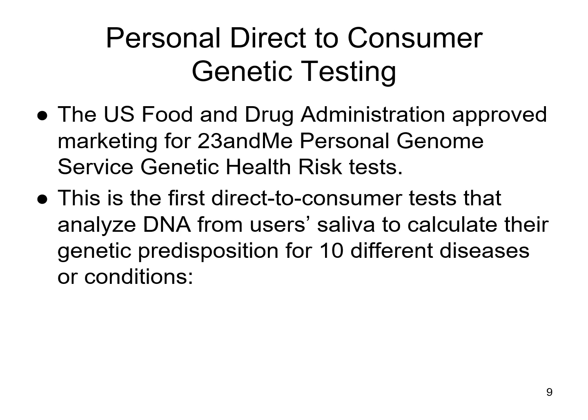There are different things, like where patients can provide a finger prick and submit a little bit of a blood sample onto a filter paper, and various tests can be done with that. Different fecal blood tests where you can collect a fecal sample to send in for genetic or DNA type testing that's looking for certain markers to detect colorectal cancer. So there are options starting to emerge to do some diagnosis and look for various diseases.